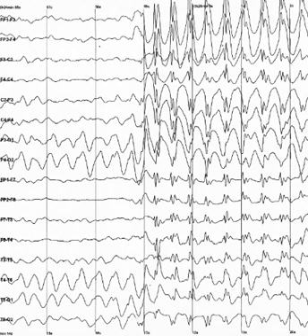Topic: Wave patterns. Delta is the frequency range up to 4 Hz. It tends to be the highest in amplitude and the slowest waves. It is seen normally in adults in slow-wave sleep. It is also seen normally in babies. It may occur focally with subcortical lesions and in general distribution with diffuse lesions, metabolic encephalopathy, hydrocephalus or deep midline lesions. It is usually most prominent frontally in adults, e.g. FIRDA, frontal intermittent rhythmic delta, and posteriorly in children, e.g. OIRDA, occipital intermittent rhythmic delta.